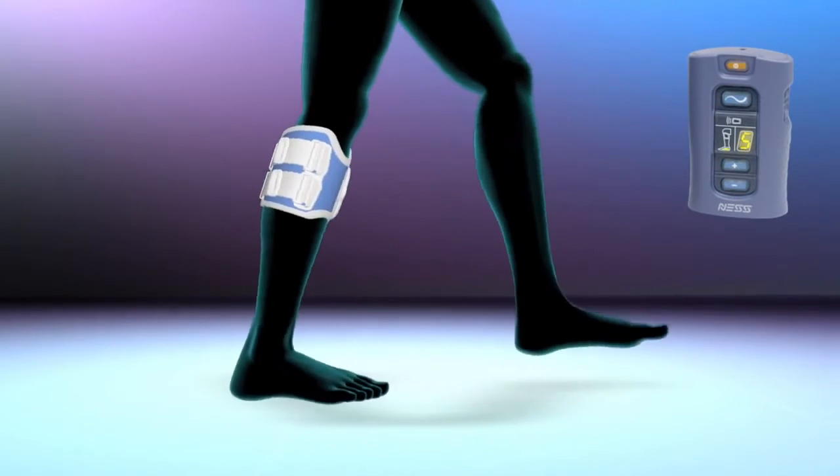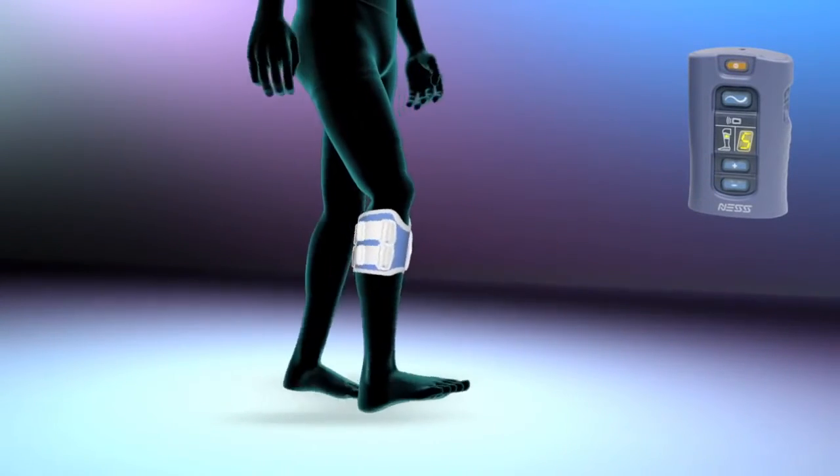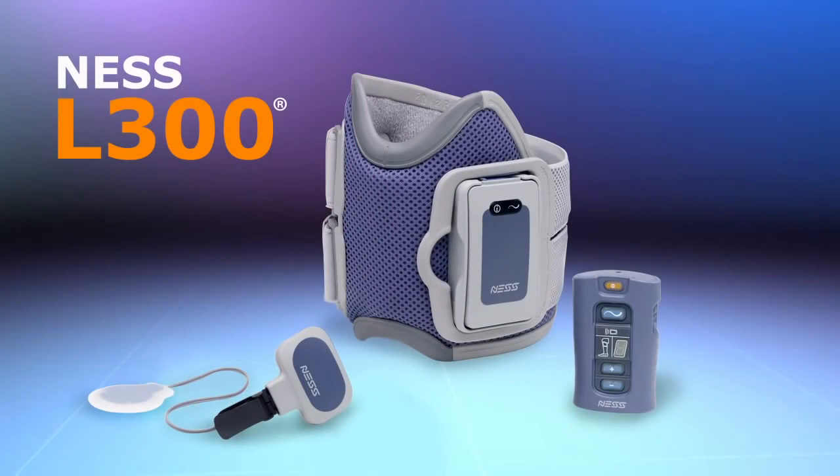The wireless control unit allows simple operation while displaying real-time information regarding the system's status. Get in step with the latest breakthrough in gait rehabilitation, and enjoy the freedom of walking more naturally with the Ness L300 foot drop system.